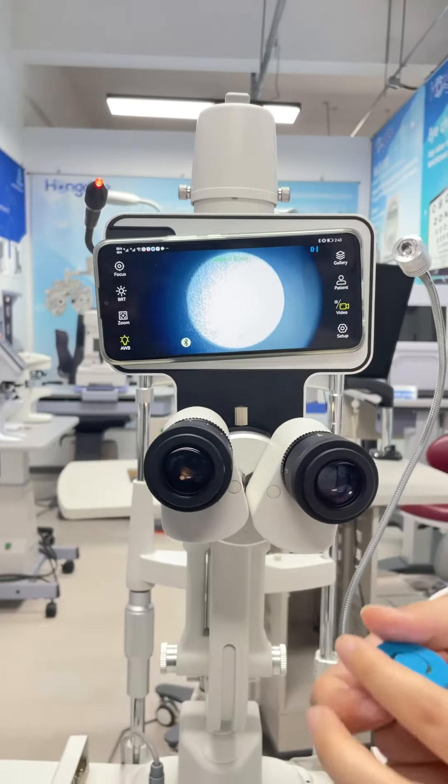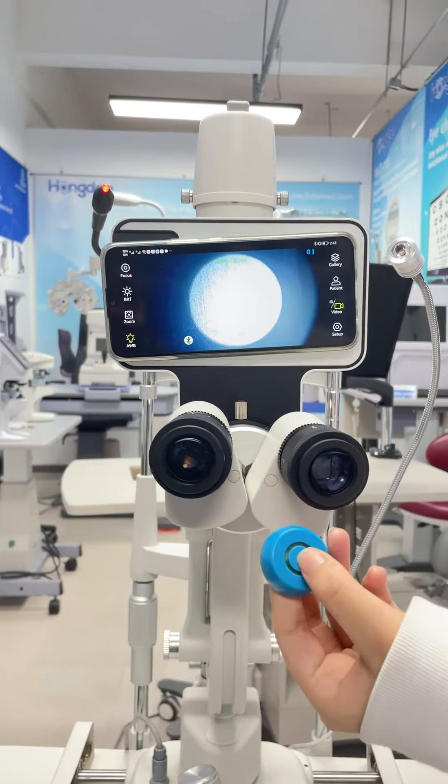See? So now we just press this shot button.